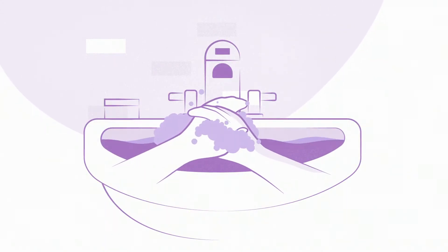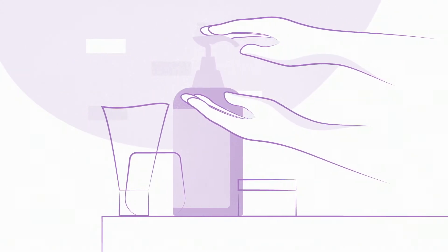Start by washing your hands thoroughly. You can also use hand sanitizer or wet wipes if you don't have access to running water.